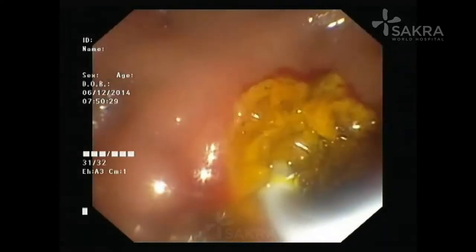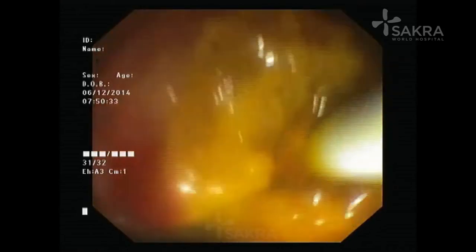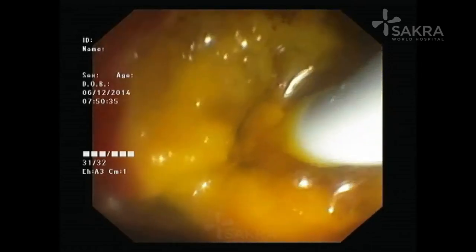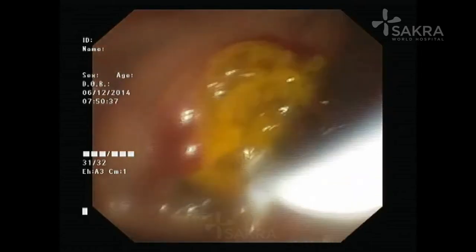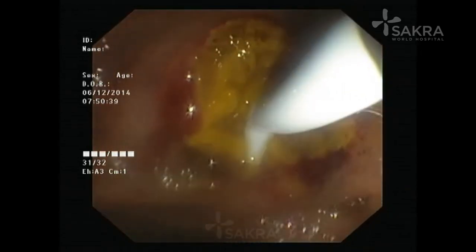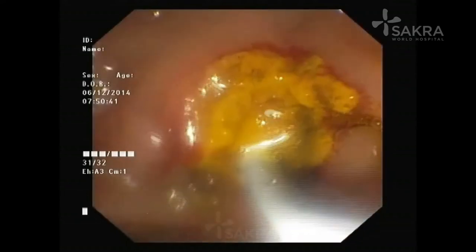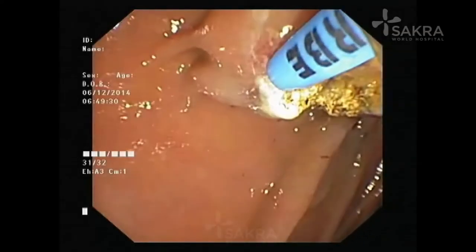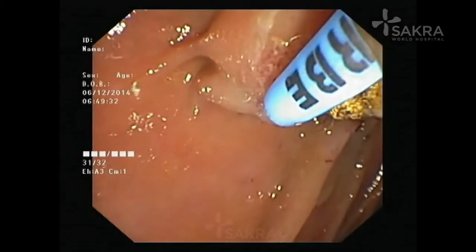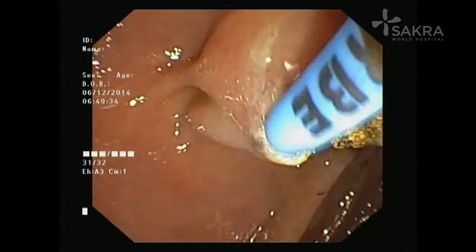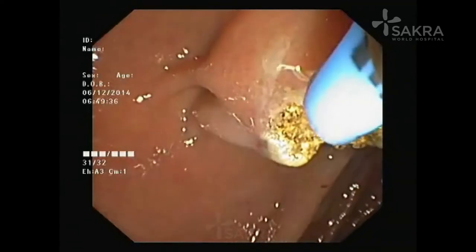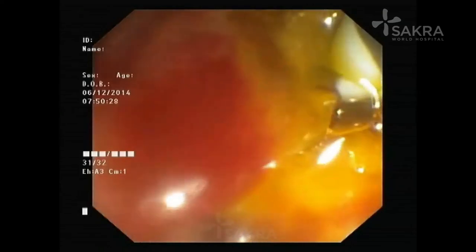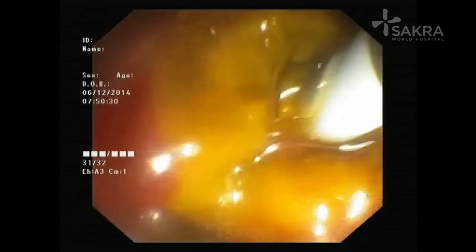We have now identified the bile duct opening — you can see the gush of bile — and we are cannulating the bile duct and leaving a stent for adequate bile drainage. This is followed by cannulation of the pancreatic duct to facilitate easy drainage of pancreatic juices. Both stents improve technical success of this procedure.